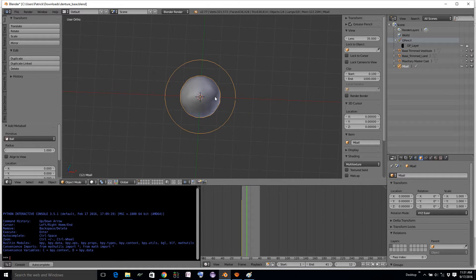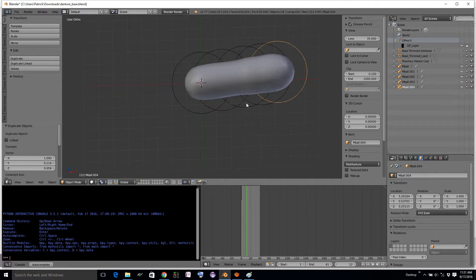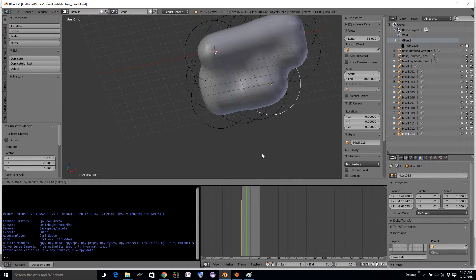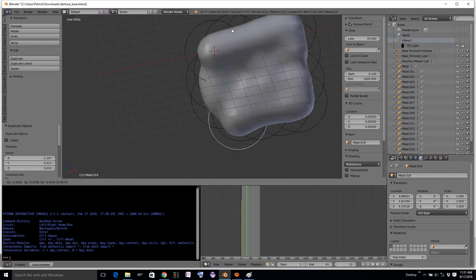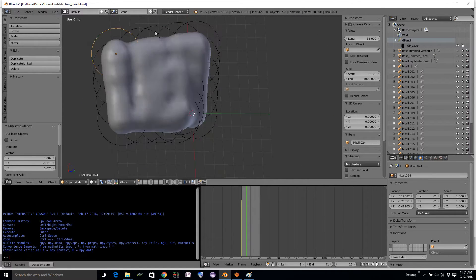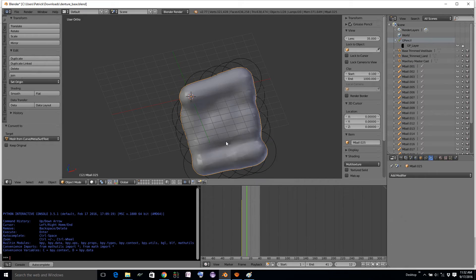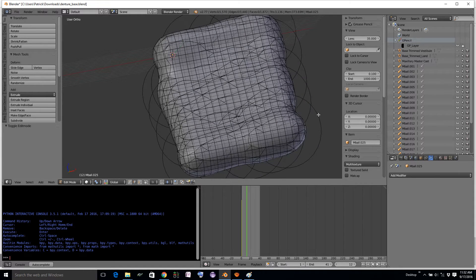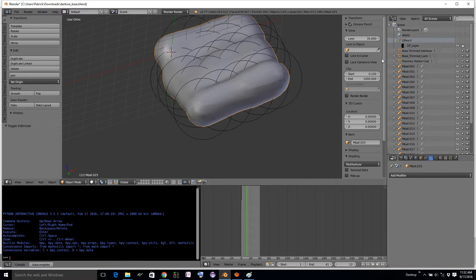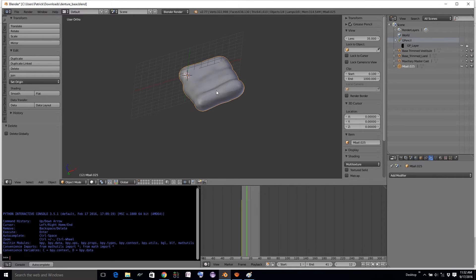The cool thing about metaballs is that they are a volumetric thing — they don't get turned into a mesh until the very end. So they have this nice clay, melted wax, bubble-like quality. All I'm doing now is duplicating a bunch of metaballs in space, and we get this kind of even surface. When you're ready to use this, you convert it to mesh. Now we have this mesh object in edit mode, and all the metaballs are still there. We'll hide the mesh, select all the metaballs, delete them, and delete our mesh too.